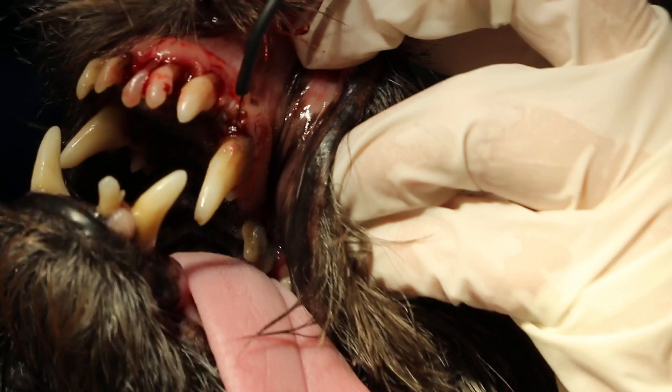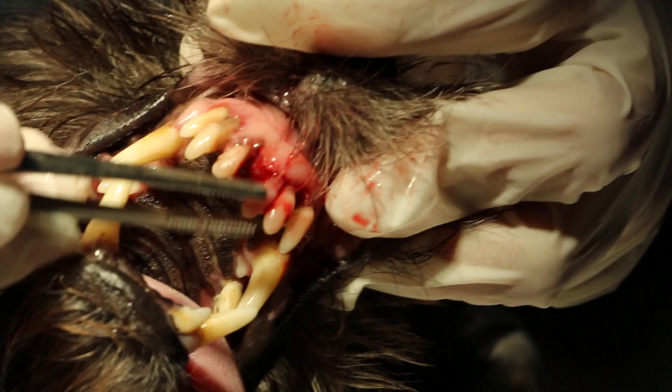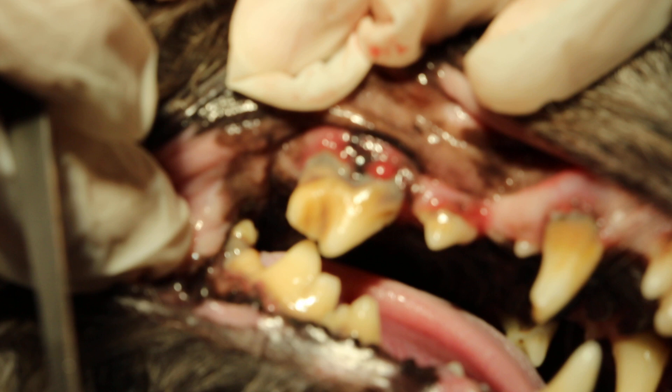You can see the teeth are quite loose. Using a forcep, you can see the teeth are quite loose because of old age and also lack of dental care in the younger days. Normally if you do dental on a dog at three years of age, you don't get these exposed roots — show the exposed roots where the black areas are. This is the exposed root.